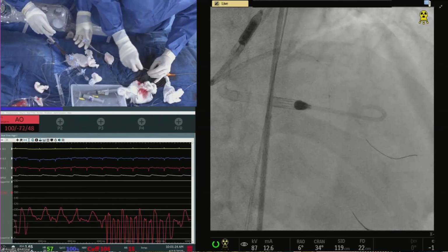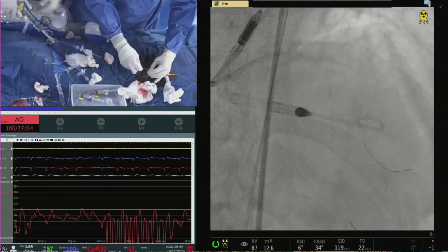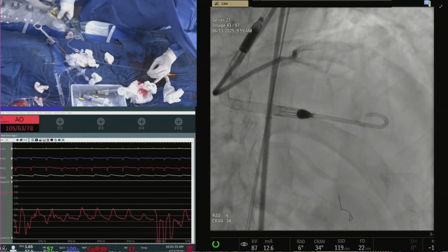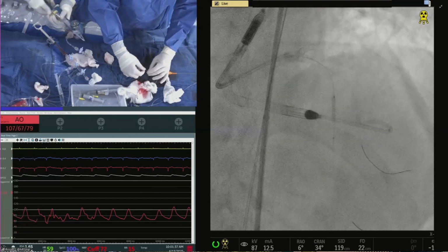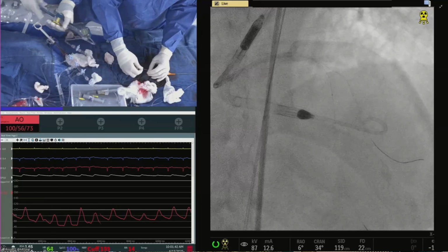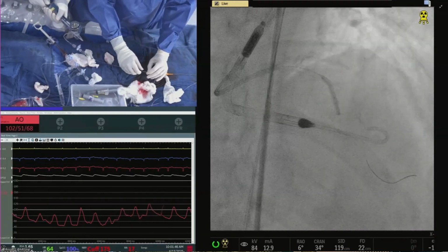Samir Kapadia, you're running a huge health center at the Cleveland Clinic on cardiology. Now, look, do you think we're using too many things here, too many devices with this? This patient has had previous bypass, I think. No, it did have bypass, but yeah, no, I don't think so. Imaging is necessary because it is going to actually save the cost at some point.